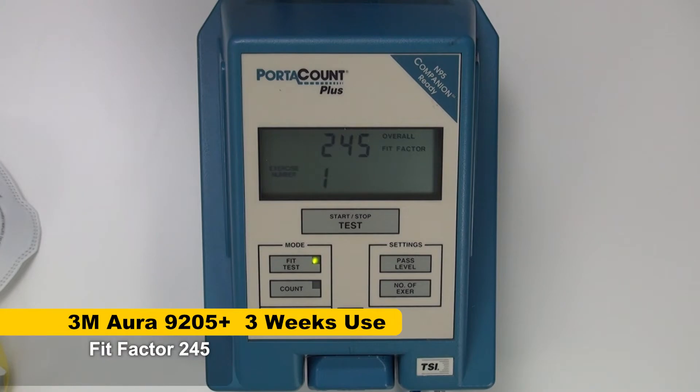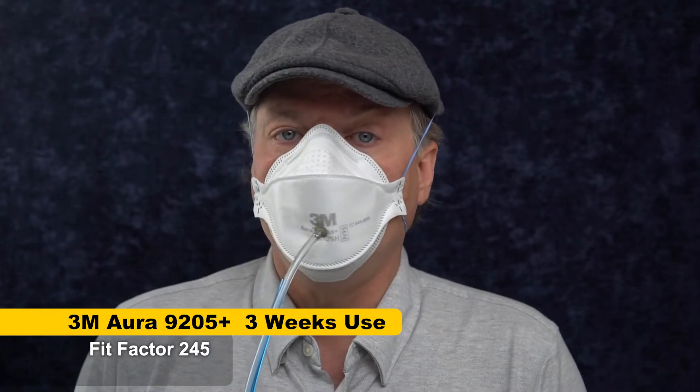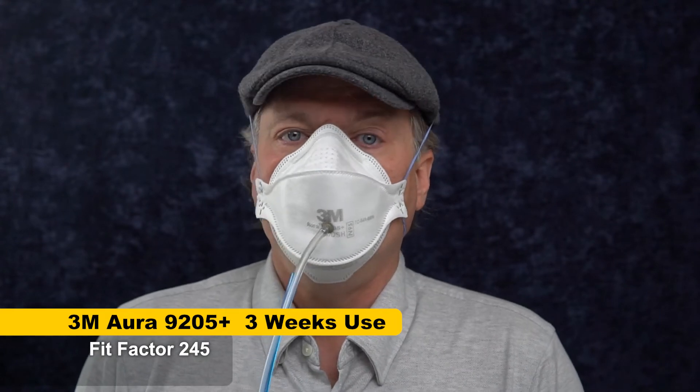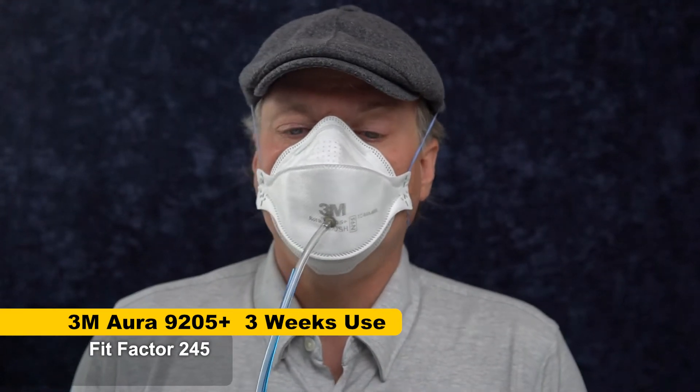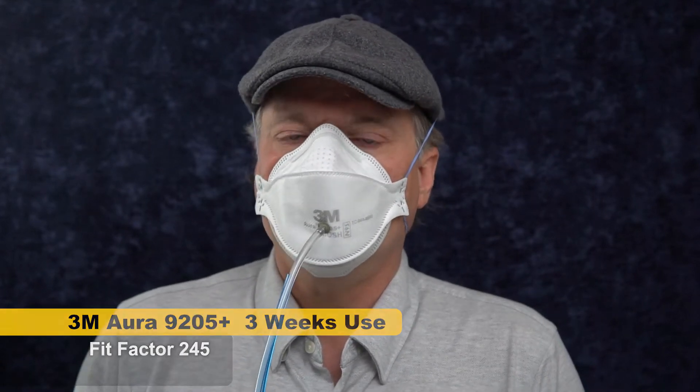Okay, 245. That is a very good score for a regular N95. It's lower than I normally get with the 3M Aura — maybe that's the straps, could be an outlier, not entirely sure. But it's not a surprise it would be a little bit lower with the straps bagged out.